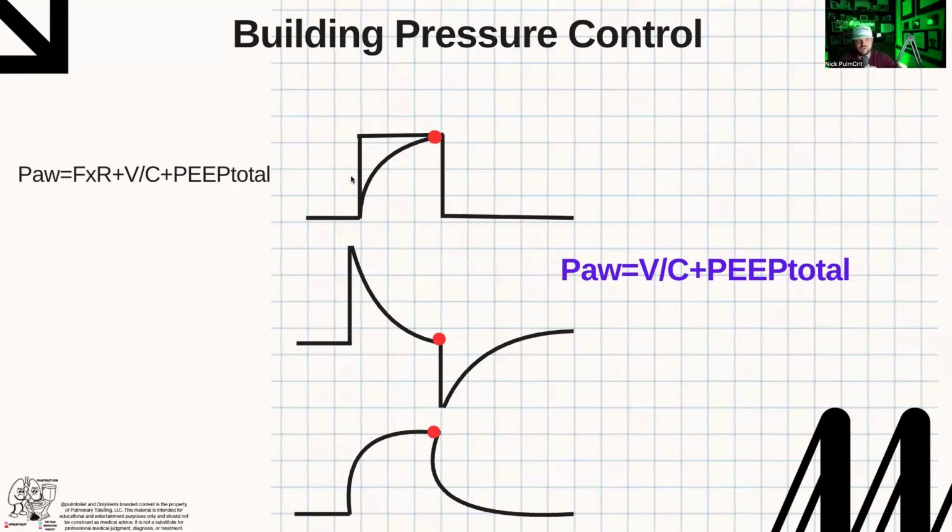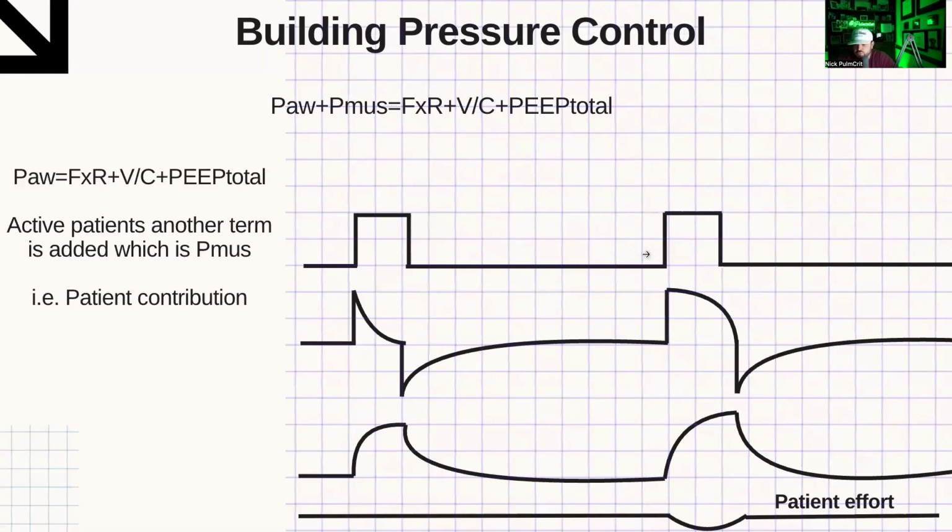Like 1 to infinity. So without directly measuring it, or if the flow curve gets to 0, then you know that there's no more delta pressure. So your airway pressure equals your alveolar pressure. It's a key concept that we overlook at times, I think. So that's important. Okay, so now this will probably have to be a whole other talk, I guess.